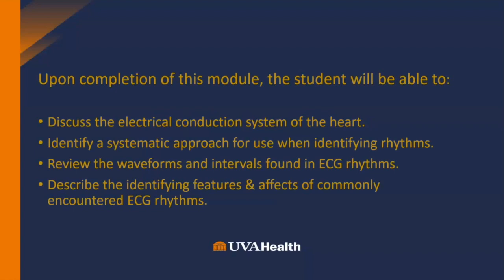And somewhere in here, we're going to also talk a little bit about therapies, but we really want to focus on rhythm recognition. And we're going to talk a little bit about the conduction system of the heart. That's important to know just because some of the medications we give work in different places. And an EKG will look different depending on where it comes from. The heart is much like your fist, depending on from what angle you look at it, it will look very different. So we want to approach that systematically. A systematic approach obviously is going to work best because if you do the same things every time, you're more likely to be successful. And then anything that you may have a question about, again, put it in the chat if I don't touch on it, or if there's some confusing terminology, or if I'm saying something that doesn't make sense.